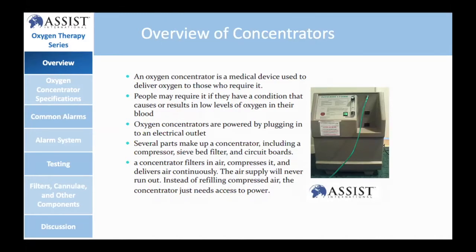Based on our experiences in low and middle income countries, today's presentation will focus on two of the most commonly found oxygen delivery mechanisms in low and middle income countries. So we'll start off with oxygen concentrators and then we'll transition to oxygen cylinders. We'd like to talk about how we have seen people manage these devices to best support patient care. And based on some of the trainings we've done, we'd like to suggest a few tips and tricks that you can keep in mind to make sure that oxygen is safely delivered.